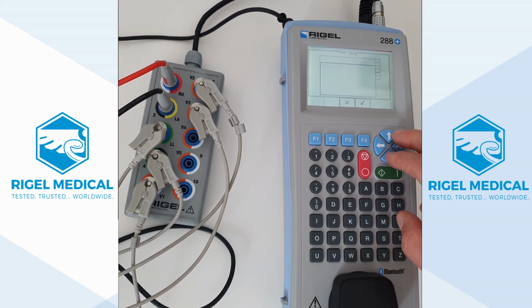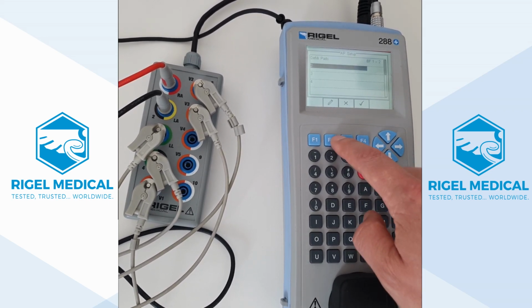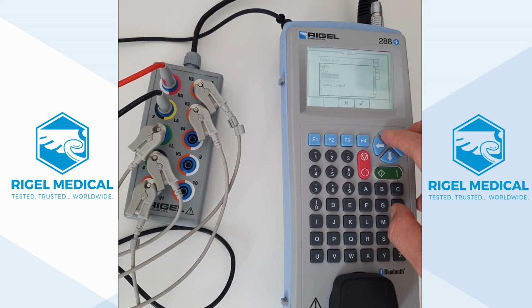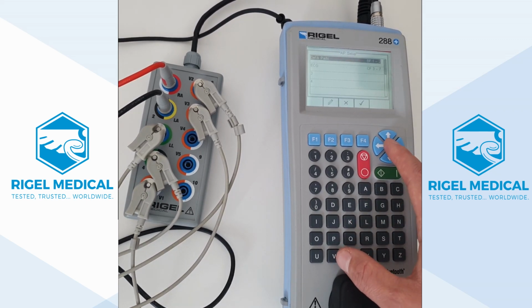But we're going to change it to defib paddles for the first one. So we've got the titles all listed here. This is BF, patient connections 2. And then we'll edit our second, which we'll call ECG. Type of classification, which is CF. Number of patient connections, we've got 5. So there we go, it's automatically set up.